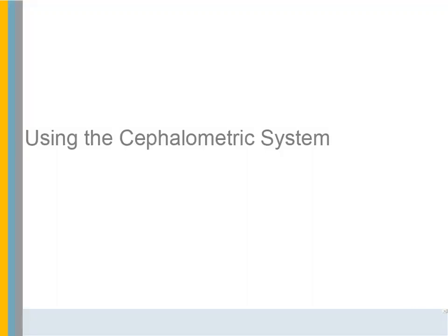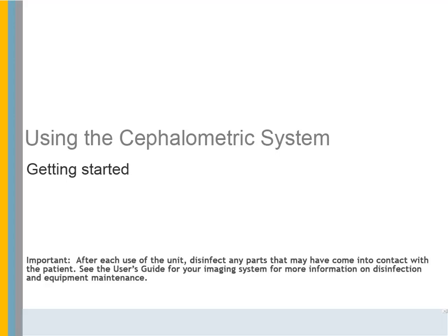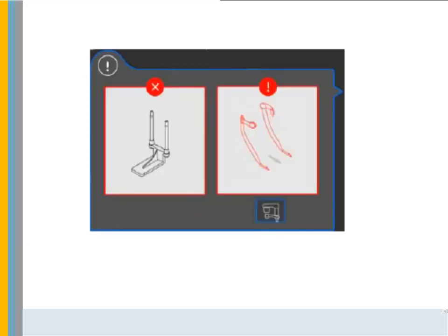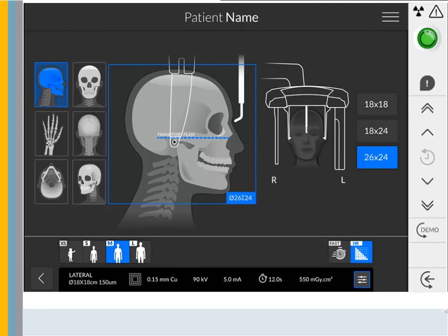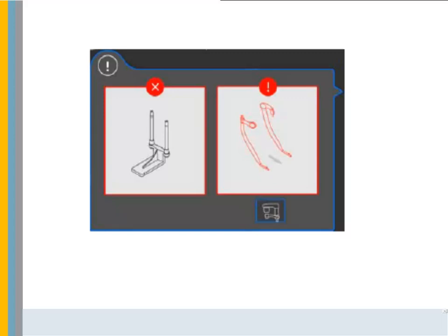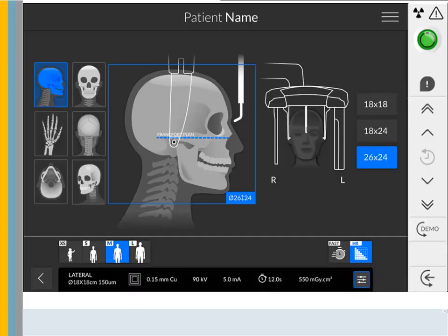Using the Cephalometric System — Getting Started. Important: after each use of the unit, disinfect any parts that may have come into contact with the patient. See the user's guide for your imaging system for more information on disinfection and equipment maintenance. After accessing the patient's record, click the Cephalometric icon to access the Cephalometric acquisition interface. On the touch screen control panel, press the patient entry icon to rotate the arm into position. On the fixed arm, remove any positioning accessory and lower the head clamps by pulling and turning them outwards. When the illustration disappears, the Cephalometric acquisition interface is ready for use.